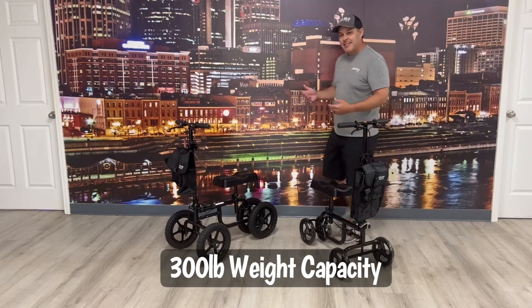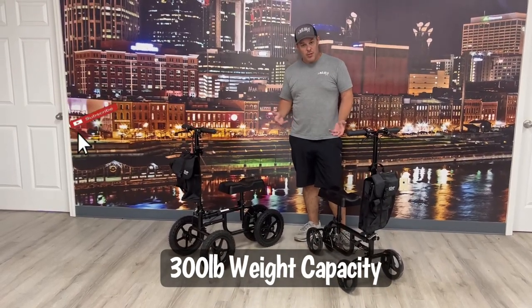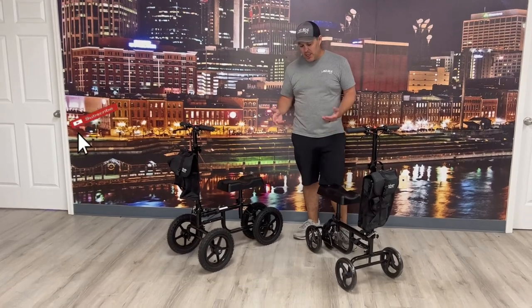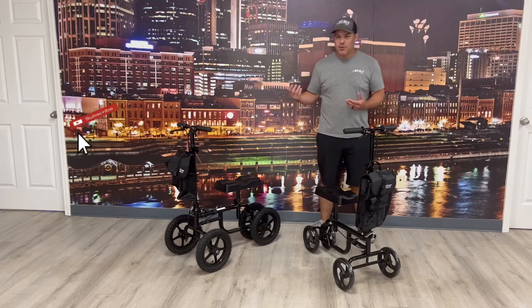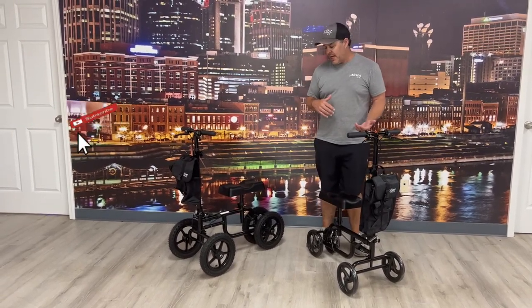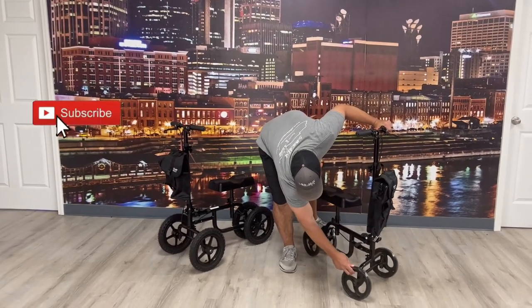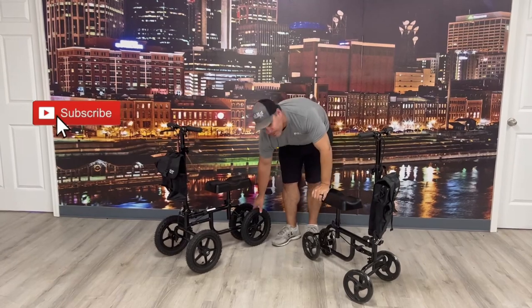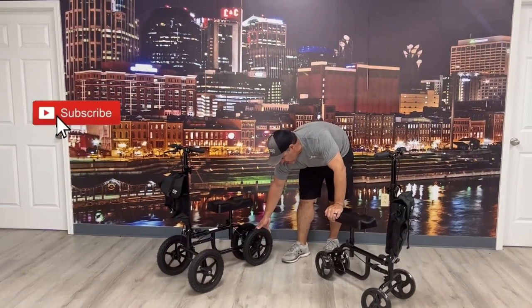They have a 300-pound capacity on both of them. As you see, the biggest difference is really the wheels. You have a lot larger wheel set on the all-terrain, which can help if you're taller or going over rougher terrain. These wheels are rubber on the standard, whereas the all-terrain wheels are inflatable, so you do have to pump them up every now and again depending on how much you're using them.